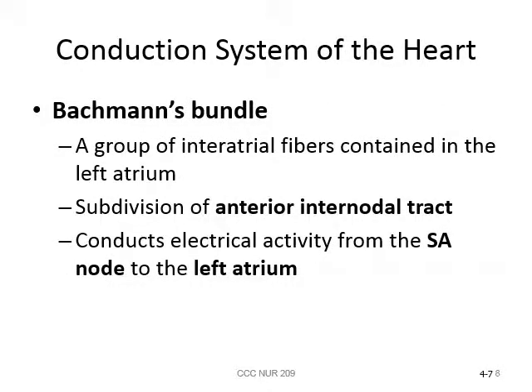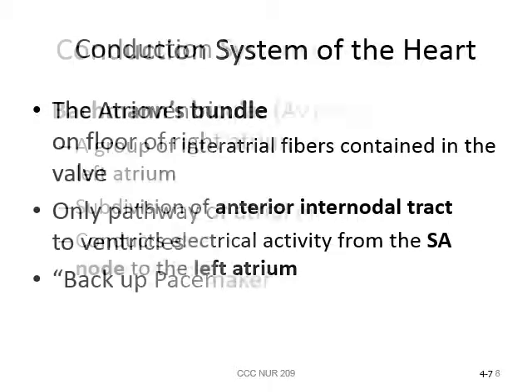Bachmann's bundle is a group of interatrial fibers contained at the left atrium. Basically, it's a subdivision of the anterior internodal tract. It conducts the electrical activity from the SA node over to the left atrium.